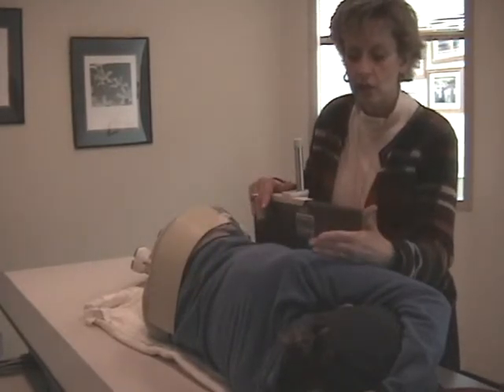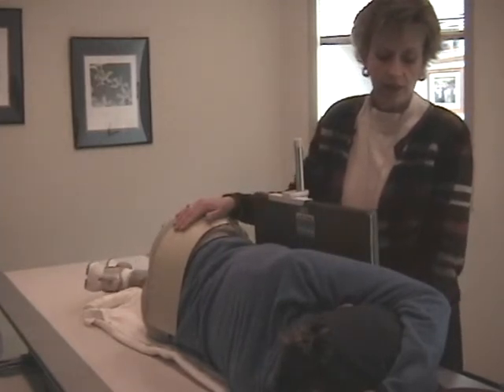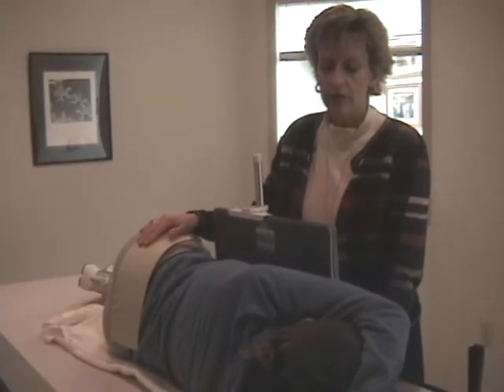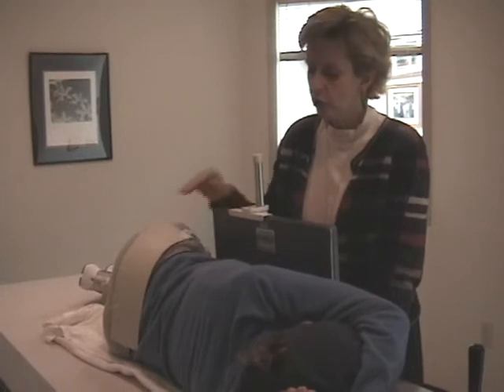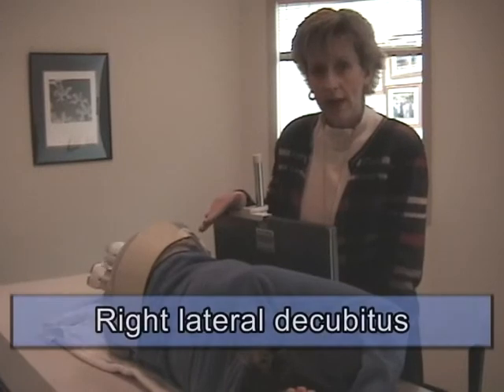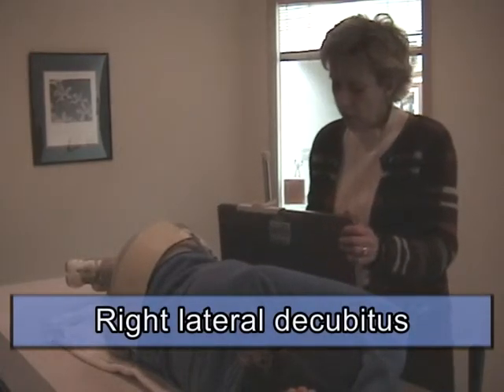Again, film's edge is 2 inches above the cervical prominence. And then you can have your patient take in a deep breath, blow their breath out, take in another deep breath, and hold it in. And this would be the positioning for a decubitus chest. In this setup, I'm doing a right lateral decubitus. So I'm just going to take the setup apart for a second.